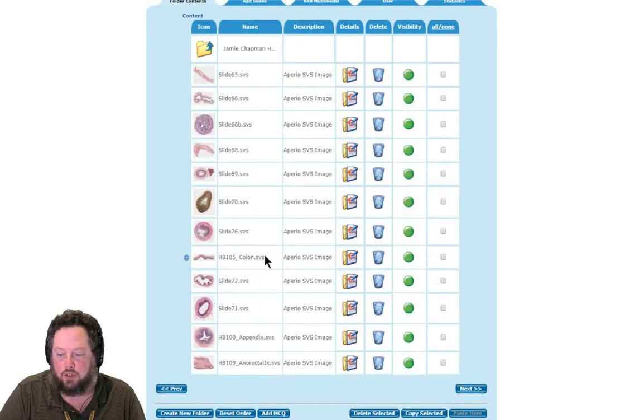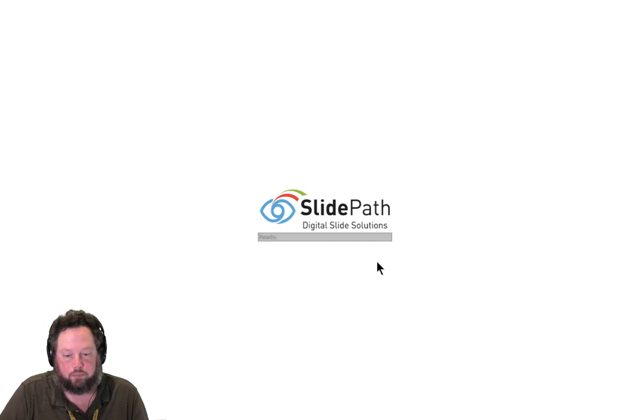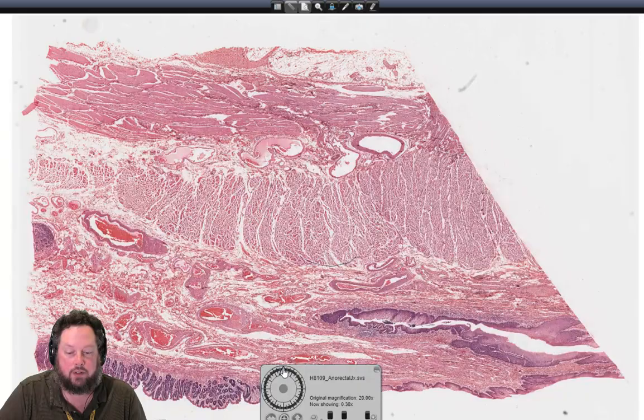we'll finish off our stream with having a look at the ano-rectal junction. Right, so I'm going to flip this around. Everyone hold their stomachs.